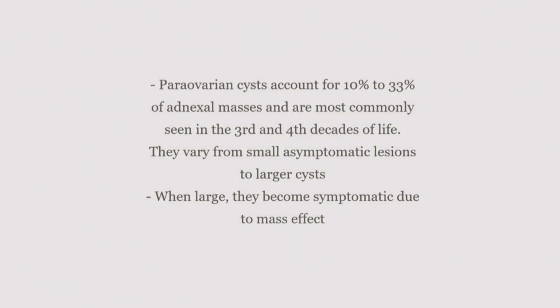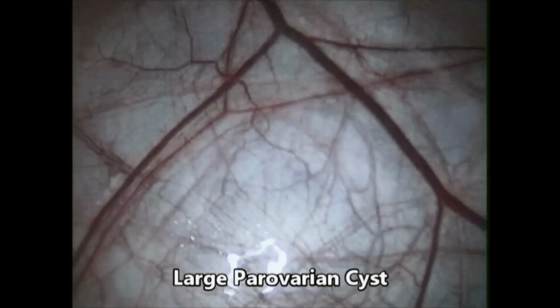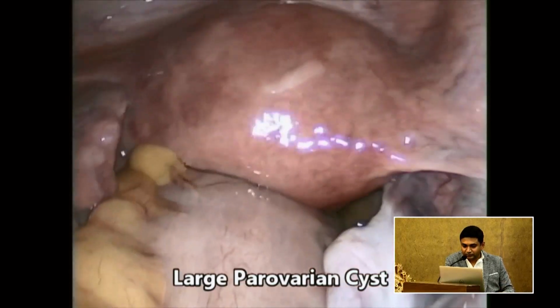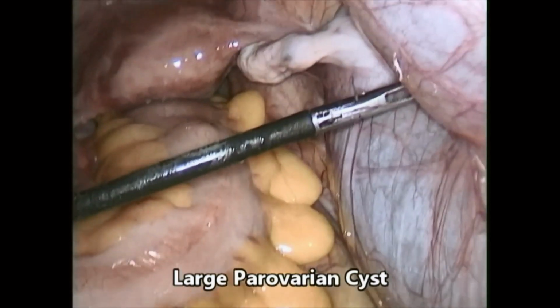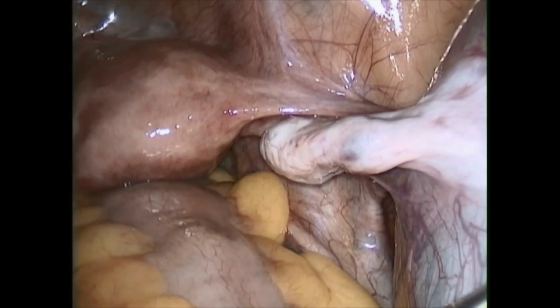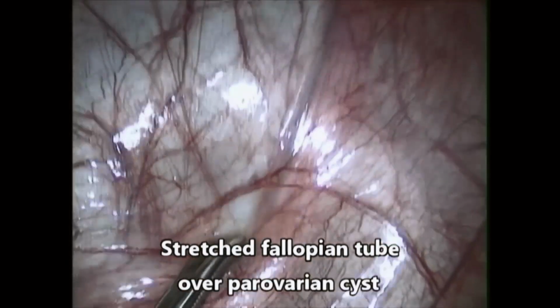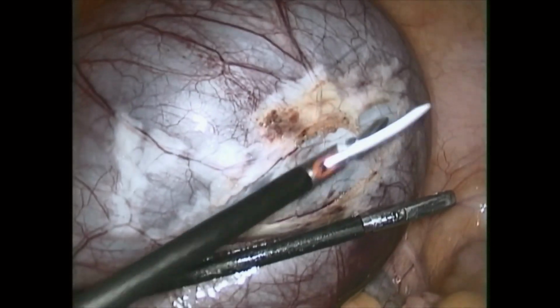Another case of para-ovarian cyst. It accounts for at least 10 to 33% of adnexal masses, and most commonly, due to distortion of the anatomy, they might cause infertility. Here a large para-ovarian cyst is noticed. You can appreciate the ovary is separate, though it mimics that it is originating from the ovary. Once you dissect it out, you will get that picture. You can see the stretched out fallopian tube over the para-ovarian cyst. It has elongated so much.